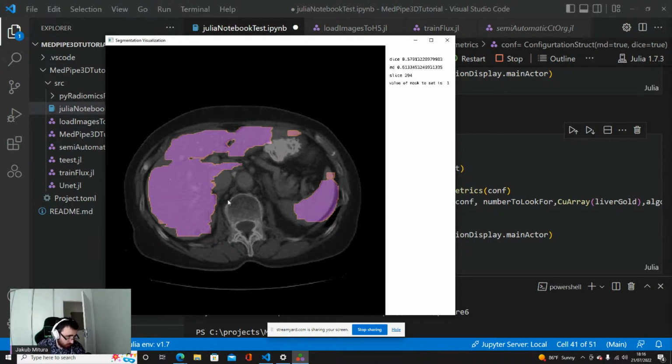From the dice metric, this error and this error, so this voxel here that is not in the liver and this voxel here that is in the liver, are equally invalid. And this is a big problem of the dice score. That's why a lot of researchers are now thinking about getting new metrics in order to look into it.